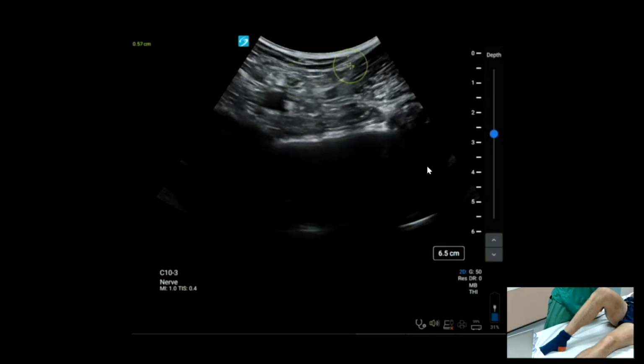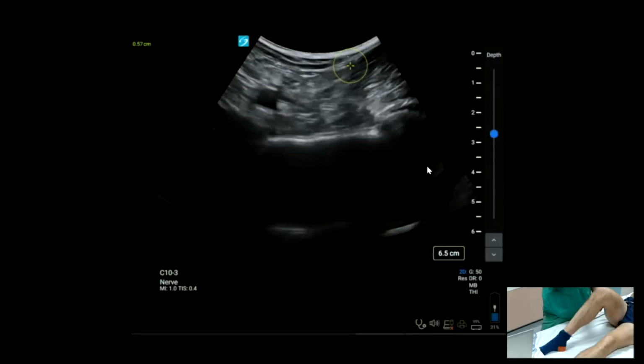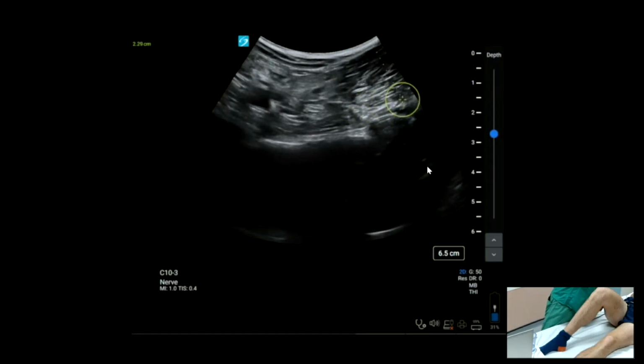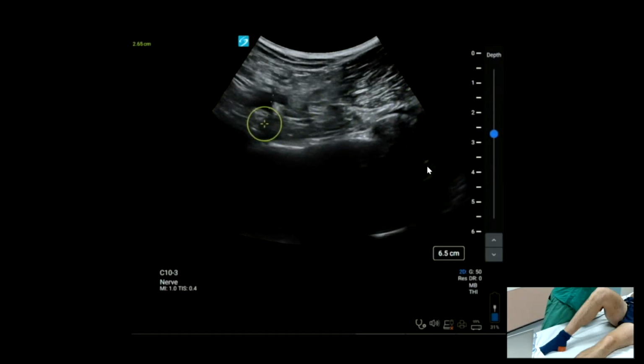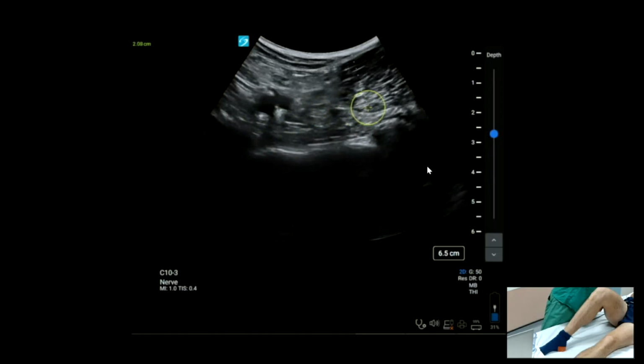iPACK stands for infiltration between the popliteal artery and the capsule of the knee. And that's literally what we're doing. We're going to be approaching from the lateral side, and we're aiming to bring our needle into this zone here, between the capsule of the knee, which is adherent to the femur here, and the artery. And hopefully we're staying well away from the nerves, which are up here.